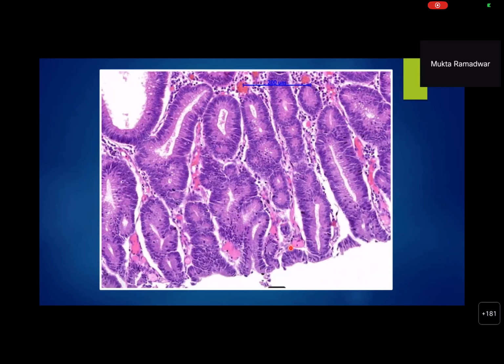First of all, the sizes and the shapes of the glands. They are irregular glands. They are very, very large glands because they contain lots and lots of chromatin, which you can easily identify by the blueness of the glands. Then coming to the individual cells, there is a loss of polarity and stratification. You remember how those nuclei were basally located, very small, very, very regular. And look at these, there is stratification. Too many of those cells exist in a single gland. Okay, so the nuclei cannot accommodate themselves, and their polarity is lost, meaning one nucleus is down, one is above. So they are not just basally located. So that is loss of polarity.